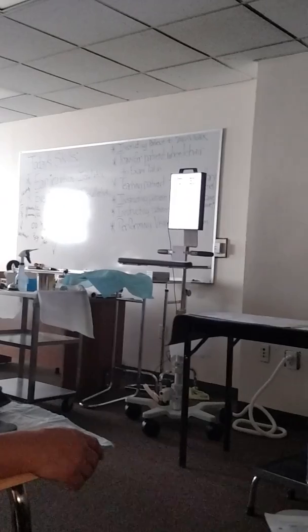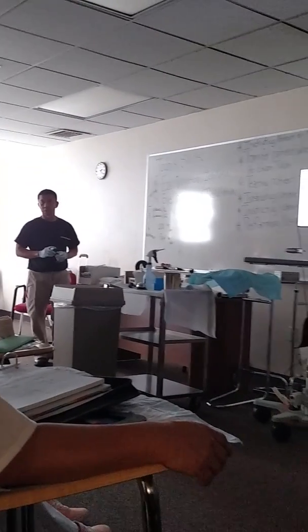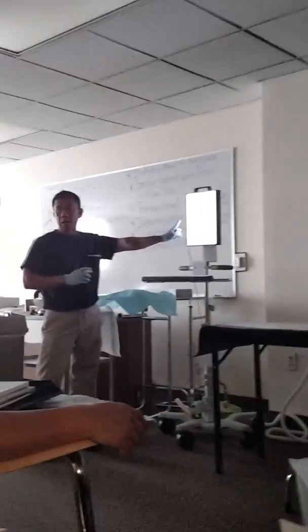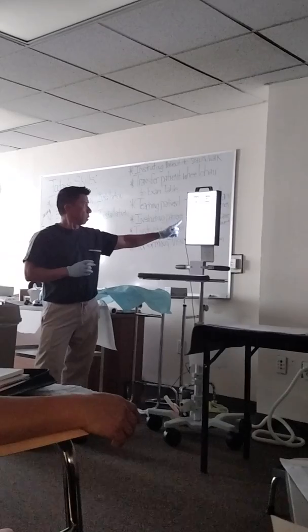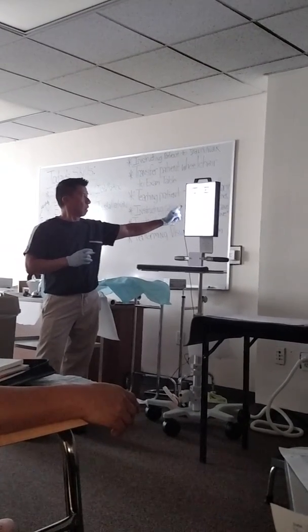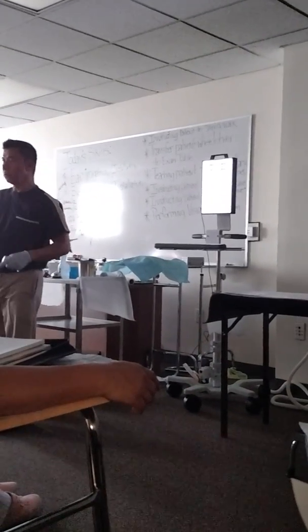Now Eric, switch over to the other eye, please. Left eye without the pinholes. Tell me what line you can read without straining. G L F E D. Okay, about the line above that? P T C O. Thank you. Okay, will you please put the pinholes down?